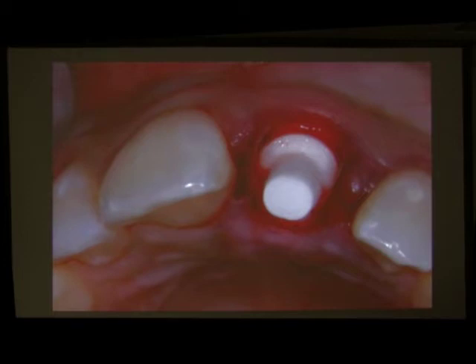a very thin layer between the coping and the implant. And that thin layer we remove with laser or electrosurgery, but just the layer on the shoulder, not in the sulcus, not deep. And when we take that layer, then because it's clean, the coping sits completely straight down.